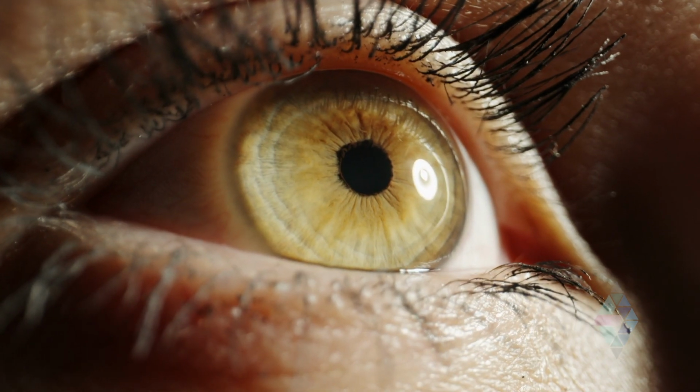And it's a very simple procedure. A little incision is made in the periphery of the cornea. The pupil is dilated with drops, and they just inject this soft implant and tuck it right behind the colored part of the eye, and it sits in front of this natural lens and focuses light rays onto the back of the eye, and people see. And it really is a miraculous procedure for these folks that nothing could be done for them, who have a true handicap.